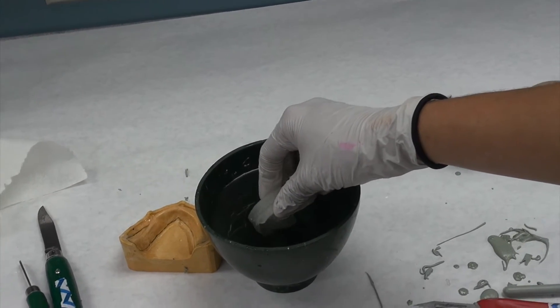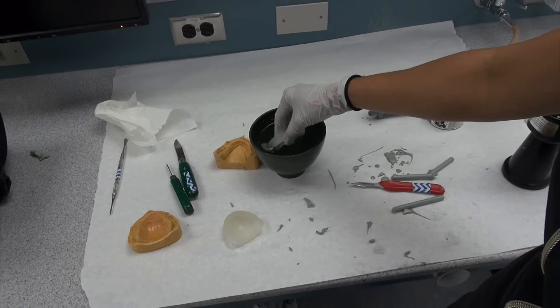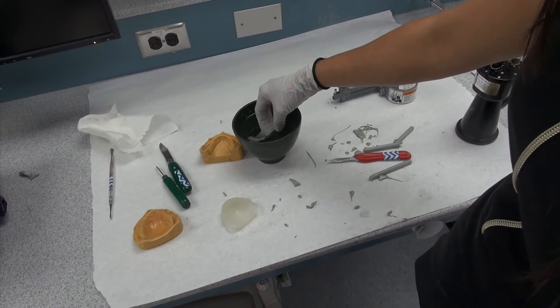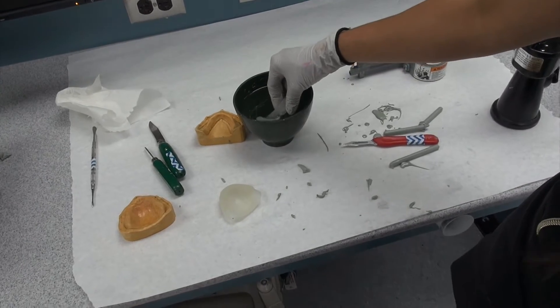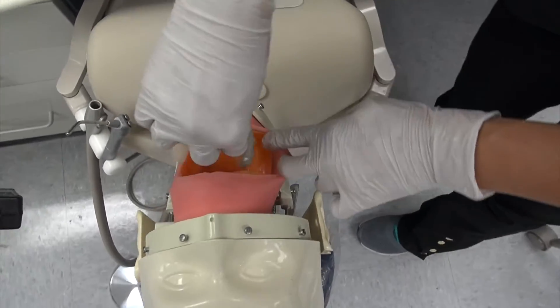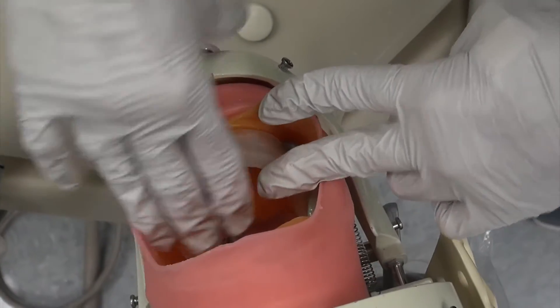Now, you're going to do each side at a time, so you'll start with the distal, you'll move to the distal buckle, you'll move to the labial, and then you'll do the flanges.